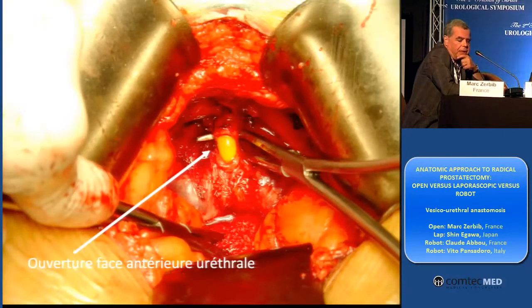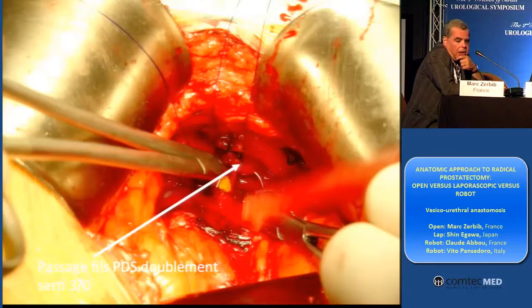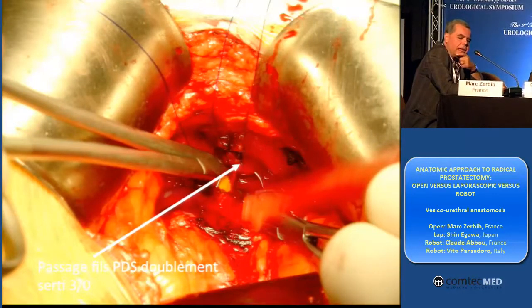I use double needle stitches of PDS 3-0. As you see, this is right.